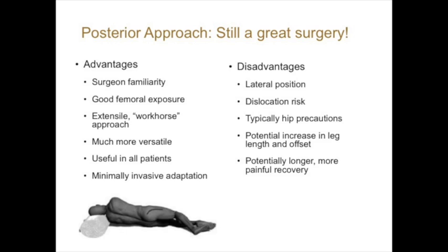It's your workhorse approach. So if you have a complication or something happens or a patient needs revision down the road, it's a much easier approach to address any issue than an anterior approach. It can be used in all patients. There are really no patient limiting factors, whether it's their size, the shape of their bones, or any congenital abnormalities or dysplasia. And as Dr. Shields mentioned, we do a minimally invasive adaptation to this, which does spare some muscles.